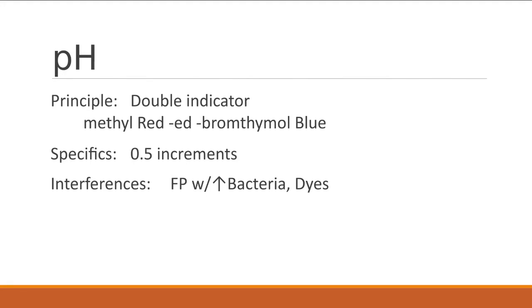These go up in 0.5 increments, and you should never have anything that's above 8. Anything above 8 is not clinically possible. Same as if it's something below 4.5, you would question that as well.